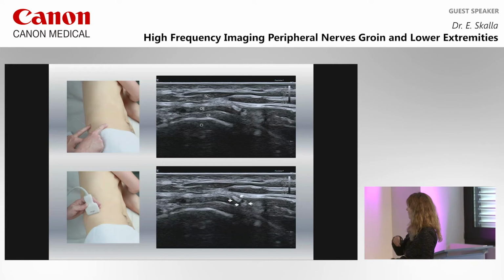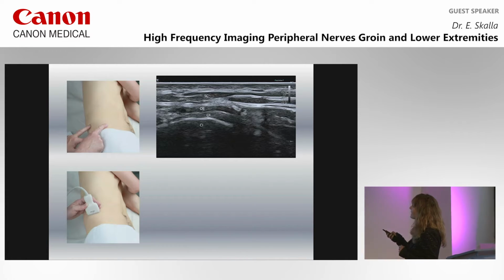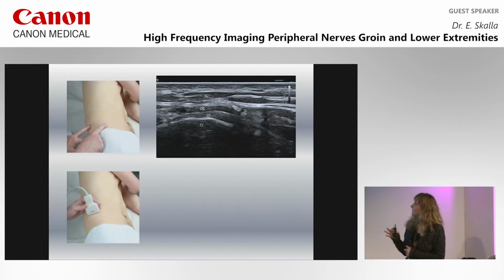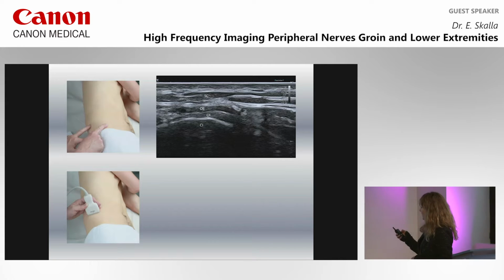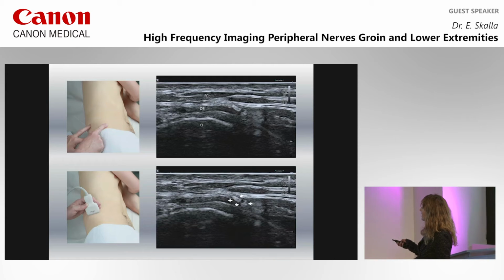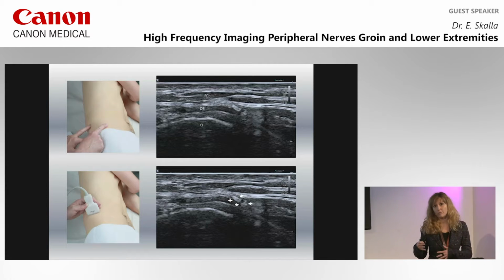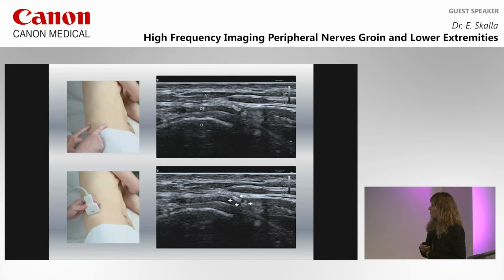The high echo of the bone. Then the 2 layers here are only 2 layers because we are very lateral: the internal and external oblique muscle. Over it, there's just subcutis. And the point of optimal visibility, where we can find this lateral cutaneous branch, is where it pierces the external lamina of the external oblique muscle. And we can see here this cross-section area of the nerve. When it runs forward in a subcutaneous course, it's usually very hard to see.